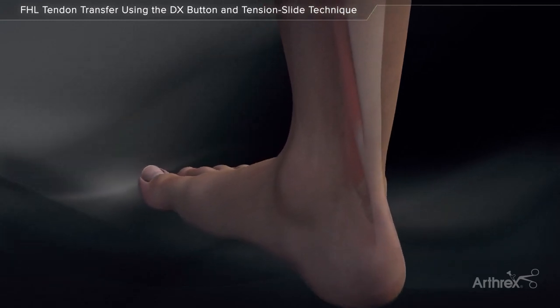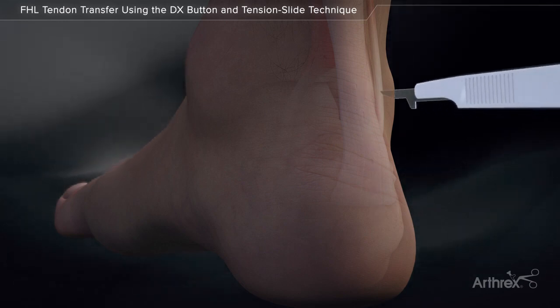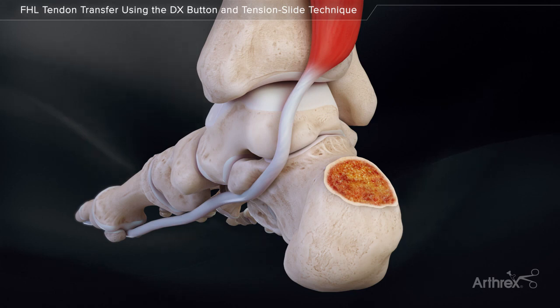Flexor hallucis longus tendon transfer with DX button and tension slide technique. Make a 5 cm to 7 cm longitudinal incision through the midline of the Achilles tendon. Use fine scissors to make the incision deeper until the FHL tendon and its muscle belly are identified.